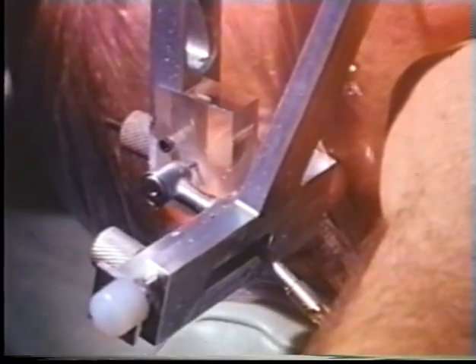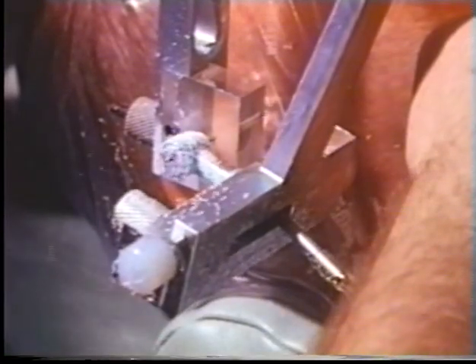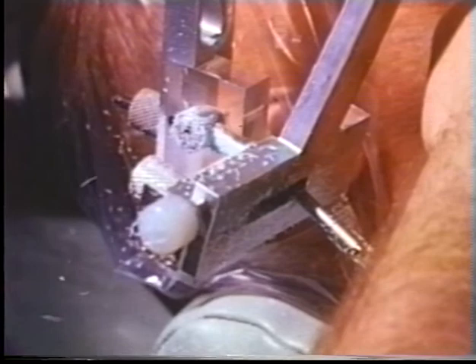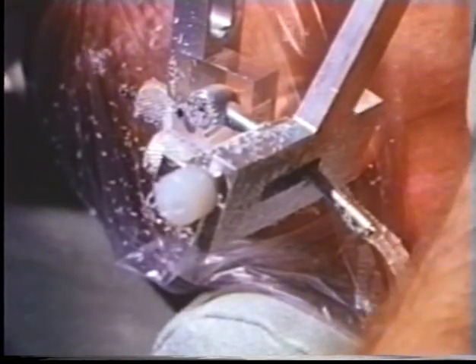The left lateral movement is shown being recorded on the right side of the patient. While the right side drill is recording the left lateral movement as shown here, the left side drill, which cannot be seen, is recording the same movement in a reverse direction. The mandible is returned to centric relation with the drills inactive.